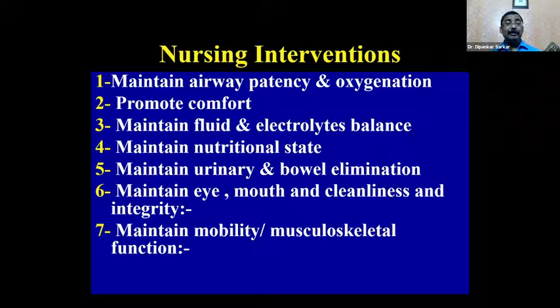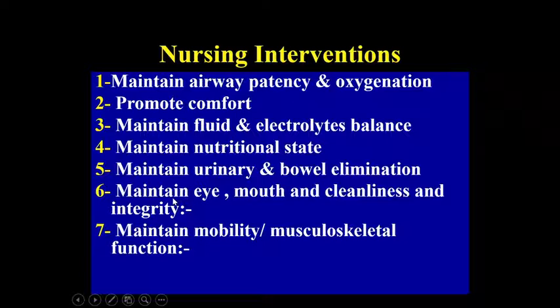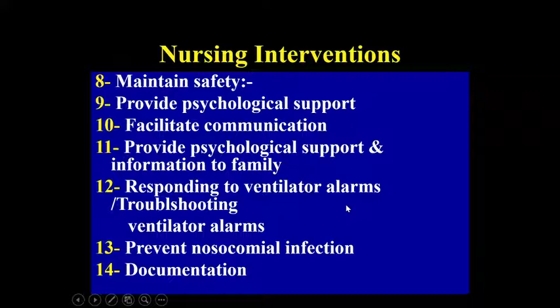Make sure the nutritional state is well taken care of and the nutrition is well maintained. The urine output and bowel elimination should be looked into. Care of the eyes. For a ventilated patient, care of the eyes is very important, especially those patients who are on non-invasive ventilation. The air can cause redness in the eyes. So that is very important. And maintain the mobility and the musculoskeletal function. Maintain the safety, the electrical safety, the psychological support. Try to communicate and try to push the patient psychologically. And the important thing is that you respond to ventilator alarms.